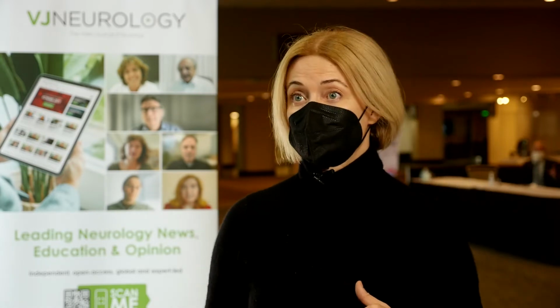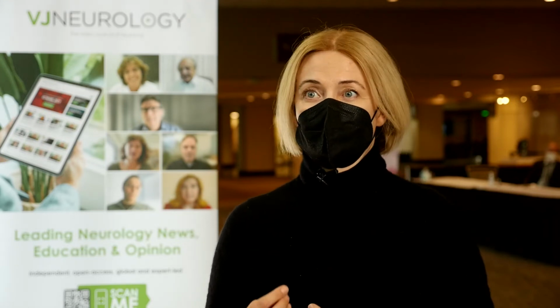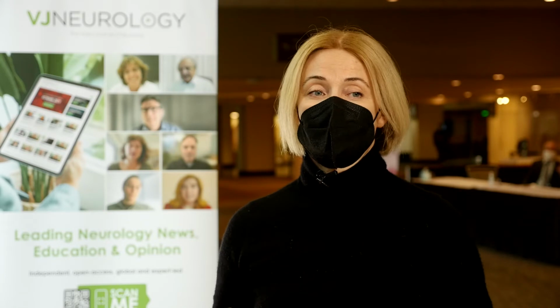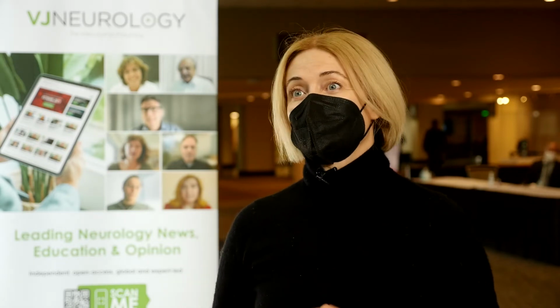So many of the failures in improving lower limb function and walking in people with MS with neuromodulation, I think, were ascribed to 2 things. One is that the stimulation was not reaching the exact target area, and that we overcome this with the appropriate device. And the second was that the interventions were too short, like 5 days treatments, and so this would not be enough. So we try to put together the best combination. But I think that the 3 weeks were not even enough.